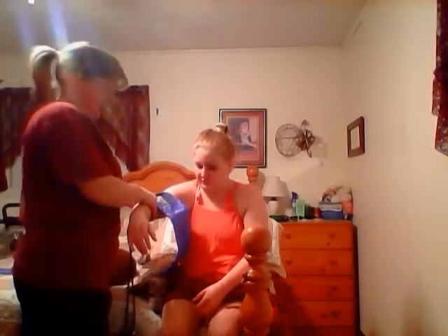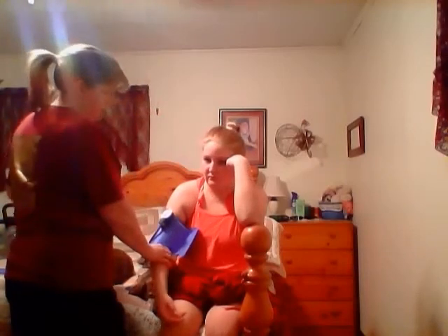To get the blood pressure, you want to feel for the artery. Make sure you place the cuff on that area where it tells you to. And to obtain the reading as to where you'd want to go up to, you'd continue to feel that artery until you couldn't feel it anymore. It occludes it, and go up another 20 millimeters of mercury. So 140 is where we would go.